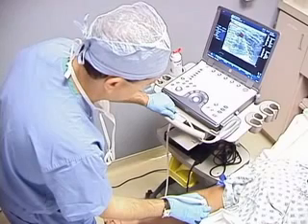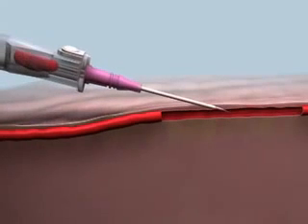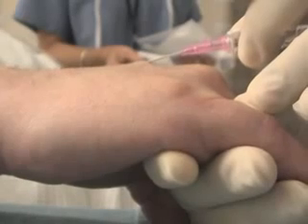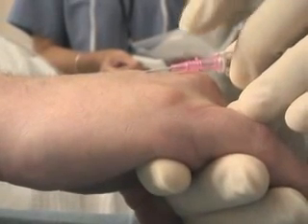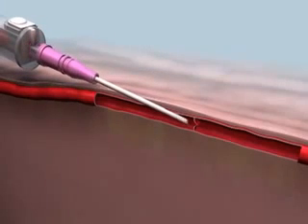These have been shown to improve the success rate of the procedure and to reduce the amount of time needed to perform it. Blood might flash back into the chamber if the tip of the needle has entered the lumen, but the cannula has not yet entered the vessel lumen itself. This problem can be avoided by reducing the angle of the catheter and advancing the needle a few more millimeters into the vein.